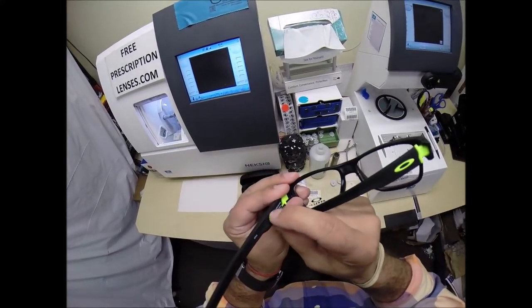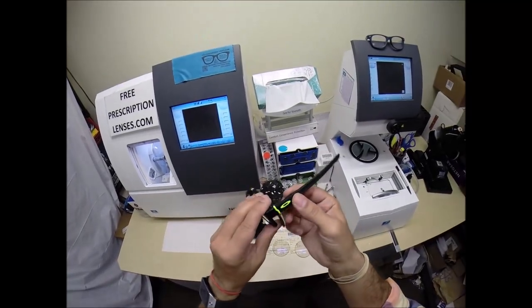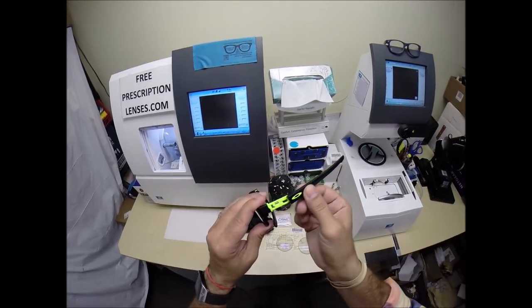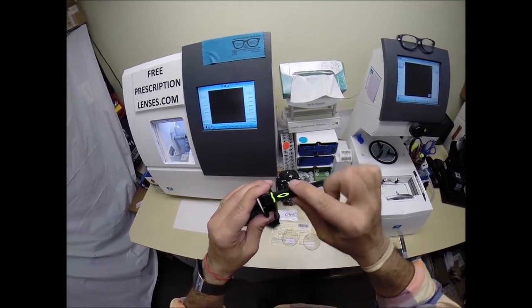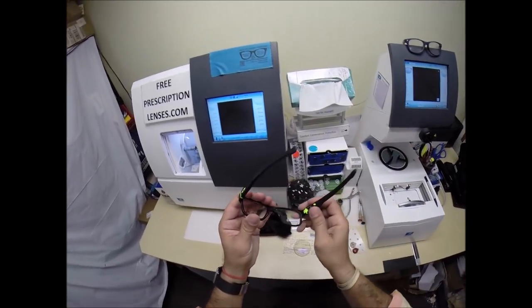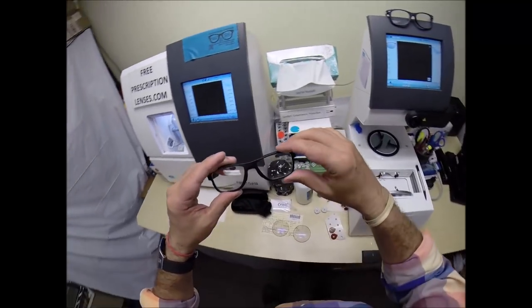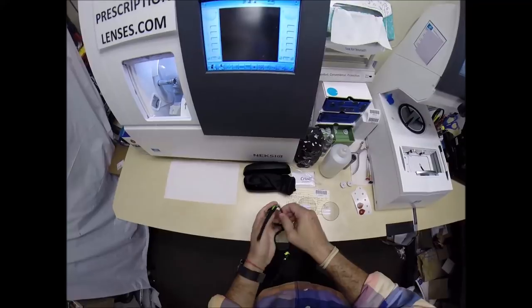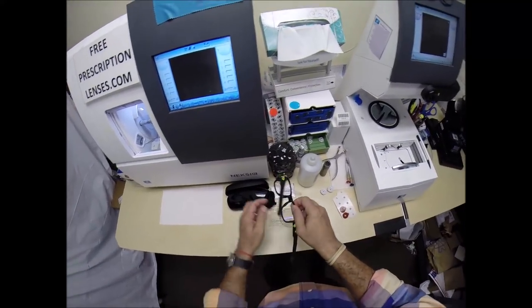You pull this little lever down right here and you can pull the temples off and change the colors of your temples. Now this little trim piece will always be that color, but you can put other temple colors on there. Let me go ahead and begin — I'm going to pop out your original demo lenses, one of which says Oakley, and of course you're going to get all the manufacturer's original packaging.